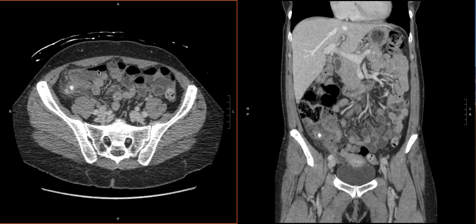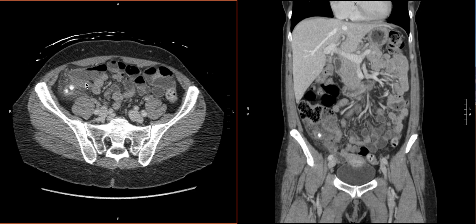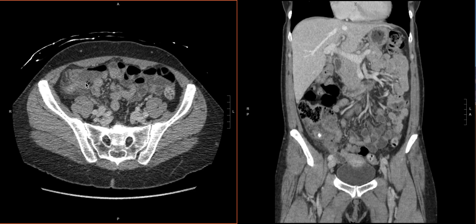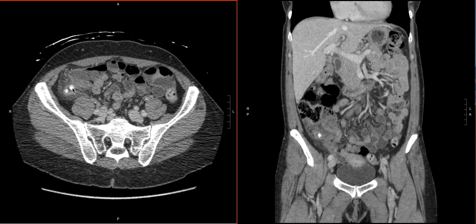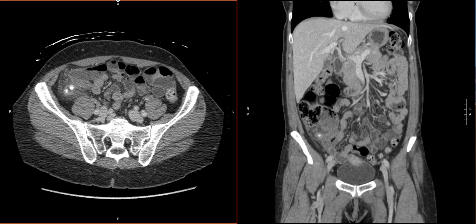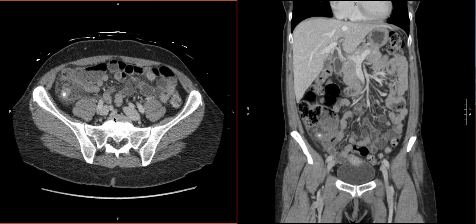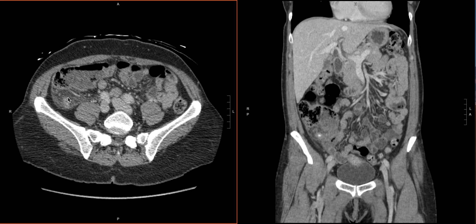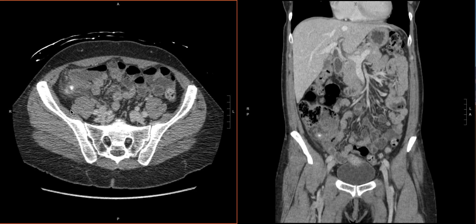Now we know that we're not dealing with something like a terminal ileitis, which can look similar at a glance. Instead, we have to look and find the appendix. In this case, it's coming off right here. What helps us are these large appendicoliths, but even if we didn't have that, we would know where to look. We can co-localize and find it on the coronal as well, confirming that this structure is the appendix and not the terminal ileum — so we've oriented ourselves.